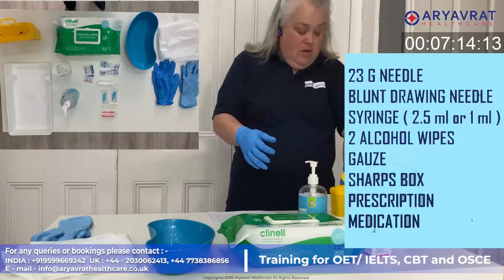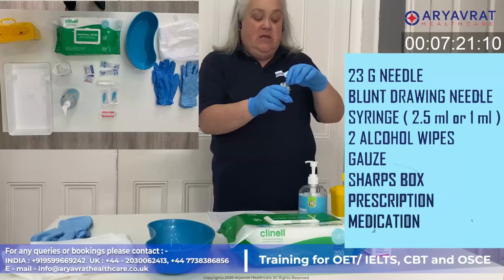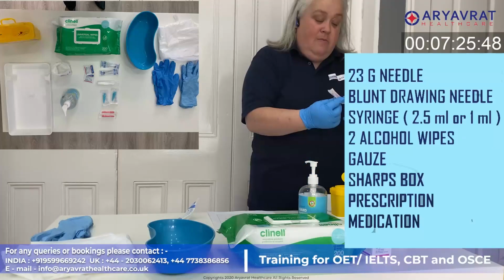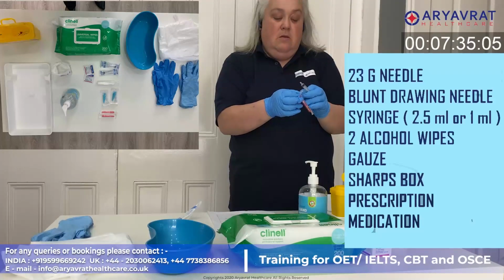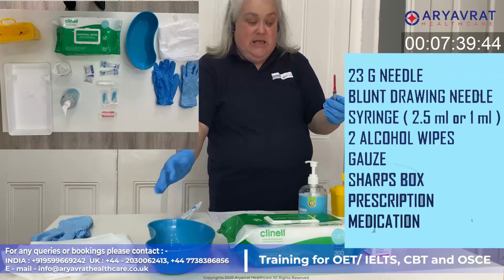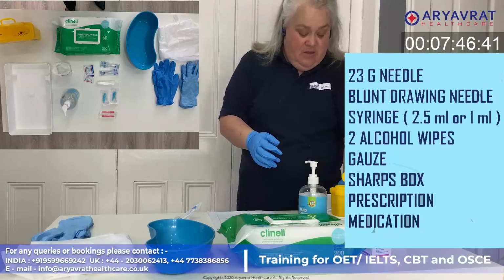Okay, so opening my syringe using a non-touch technique, not touching the tip. I'm going to do the same for the needle. Making sure that is now attached. Okay, going to make sure that I've got the opening.